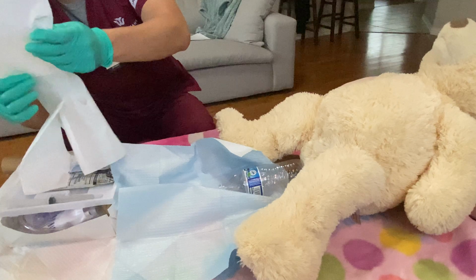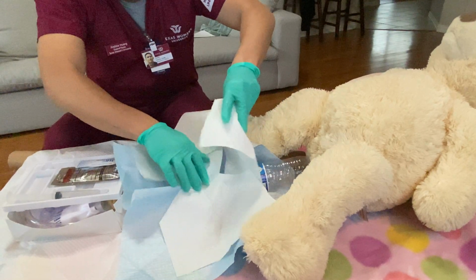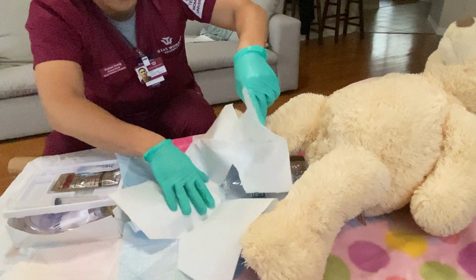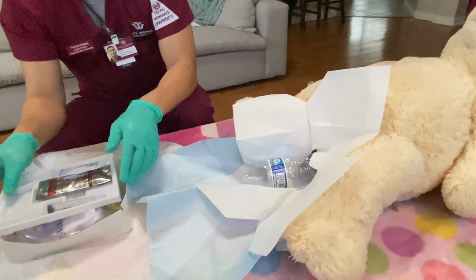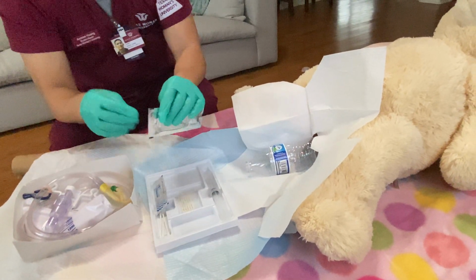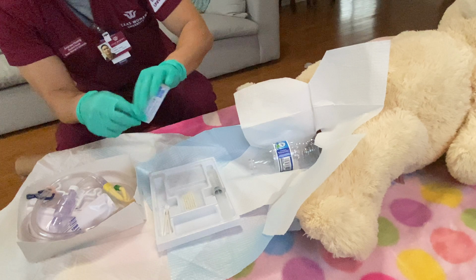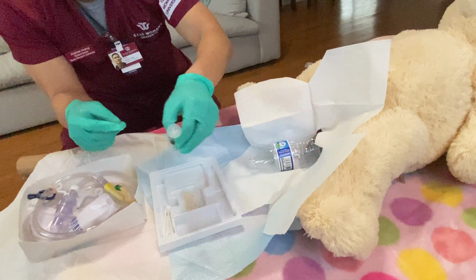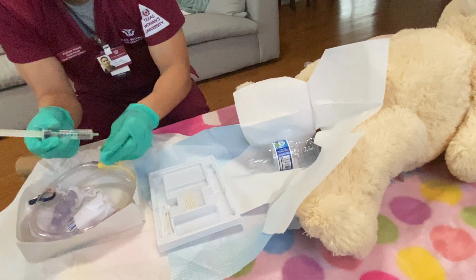And now I'll place a fenestrated pad to cover the penis here. Okay, so now I'll get my supplies out here. I will open the iodine and pour it here. And then I will open the lubricant, pour it over there. Now I'll get the 10 milliliters of normal saline syringe and attach it to the syringe port.